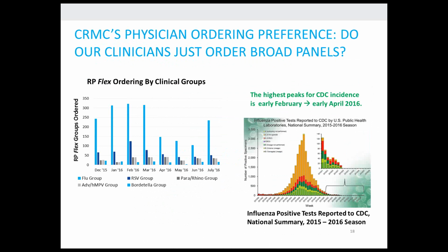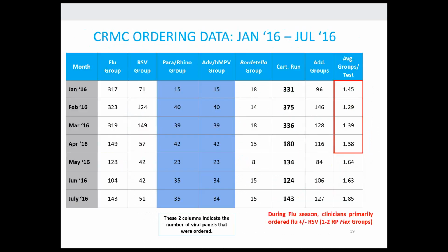Our July influenza went back up, which is interesting. That could be that we have a lot of people that have a lot of respiratory issues because right now there are a lot of wildfires going on around here. A lot of that air comes into the valley. So that explains some of the things going on with July, and August we probably will have that too.